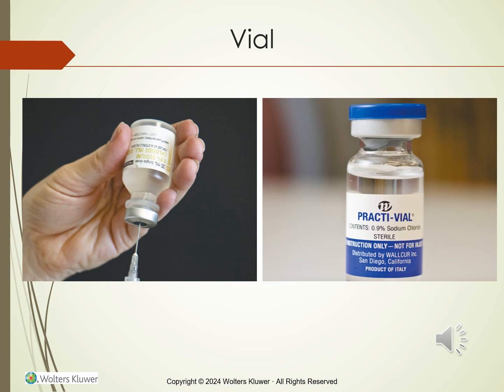This is what a vial will look like. The blue cap is on the vial to keep the rubber stopper sterile. Once the cap is removed, if it is a single-use vial, you do not need to clean the rubber stopper before inserting the needle to draw up your medication. However, if it is a multi-use vial and the cap has been removed after the initial draw up of medication, the stopper should be cleaned with an alcohol swab in between uses.